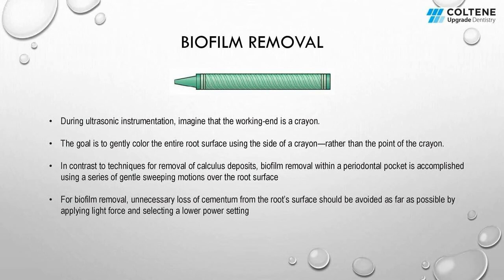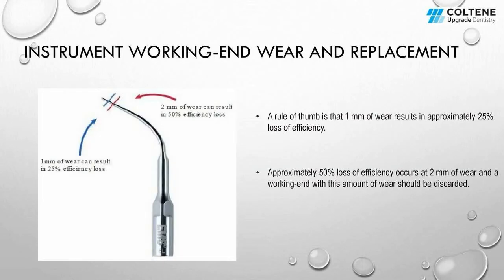In a sweeping motion, we should go from top to bottom with minimal pressure, a feather touch pressure, as it is said in the literature, and the biofilm will be removed. We should not harm the cementum as much as possible. Obviously, in case of calculus removal, the diseased cementum has to be removed, but in case of biofilm removal, that is unnecessary.